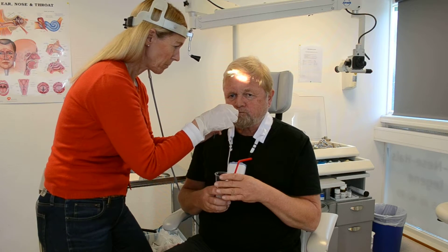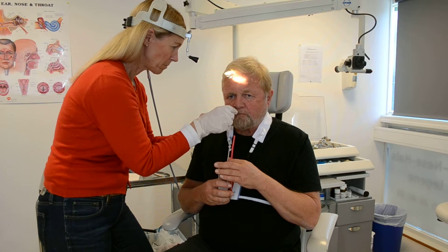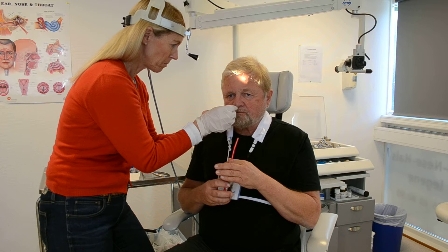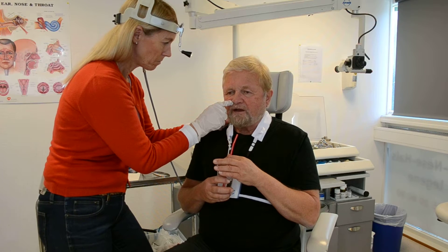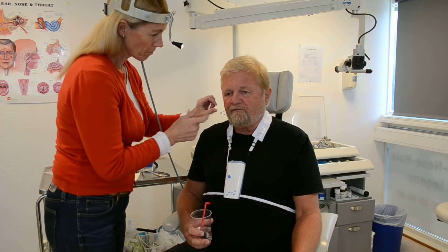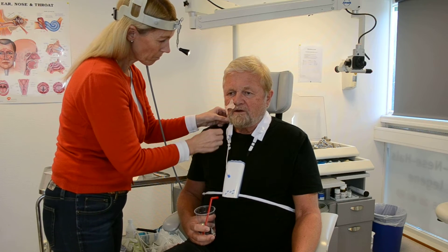Swallow. So actually, you swallow down the catheter more than having it pushed down, and the patient has no problems doing it and feels no discomfort.